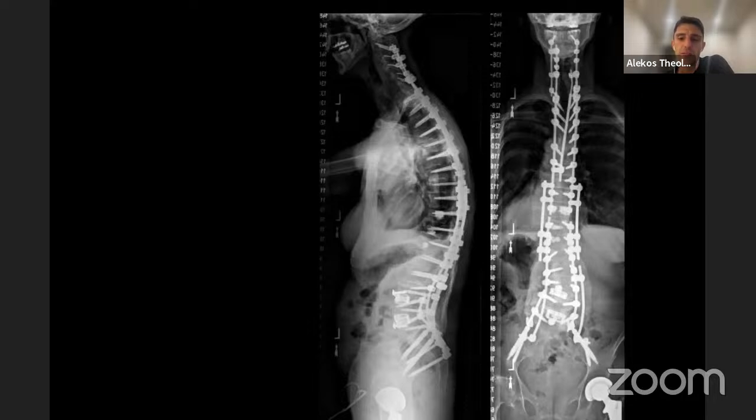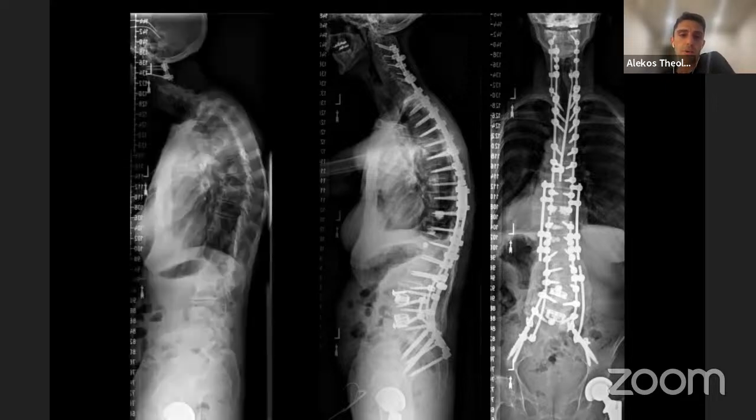You know, retrospectively, I probably should have done it in the reverse. It kind of went against my principles. At least now, I think this case also taught me that building from the base up is important. So overall, she's quite happy with her neck posture and her overall alignment.